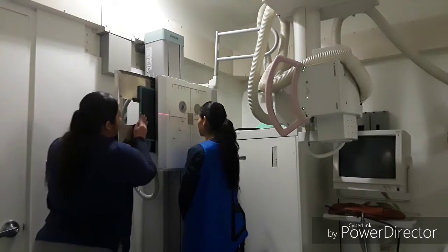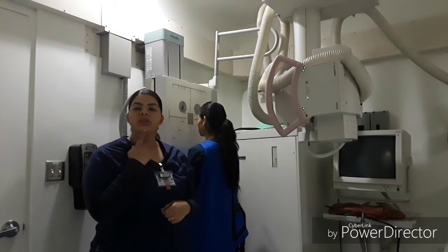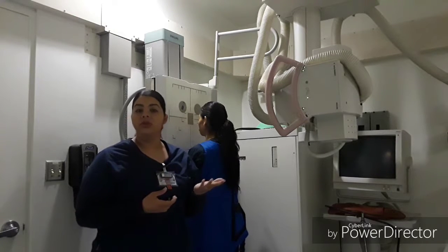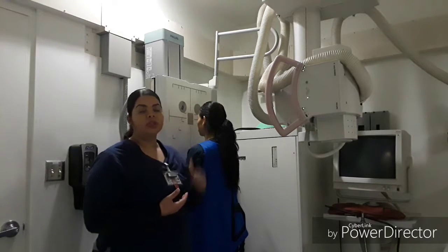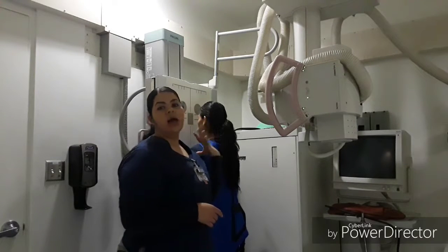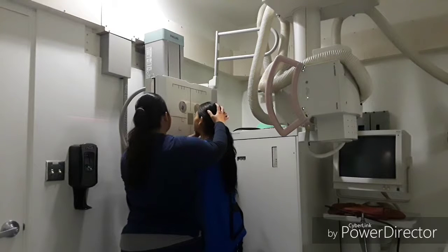I would change my IR, put in a new one, and I would also put it portrait. For this projection, we want the patient's chin to be resting on the grid. Since our central ray is still going to be perpendicular to the IR, we want the OML to form approximately 37 degrees with the IR. Our midsagittal plane should be perpendicular to the IR, and so should the MML be perpendicular with the IR. Our central ray, like I said, is going to enter perpendicular to the IR, and it's going to enter horizontal and exit the acanthion. Baby, I'm going to have you rest your chin just like that.